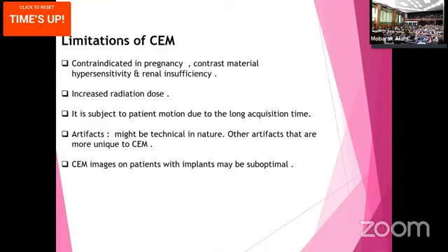This exam is contraindicated in pregnancy, in cases of hypersensitivity to contrast material, and in renal insufficiency. The disadvantage of this technique is increased radiation dose. It is subject to patient motion due to the long acquisition time, and it may produce artifacts.